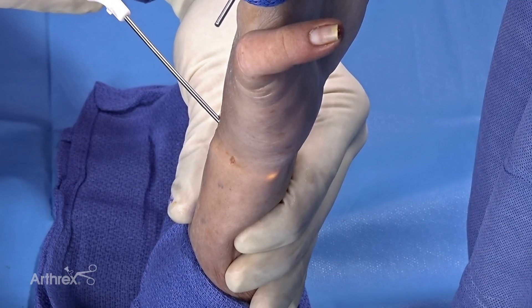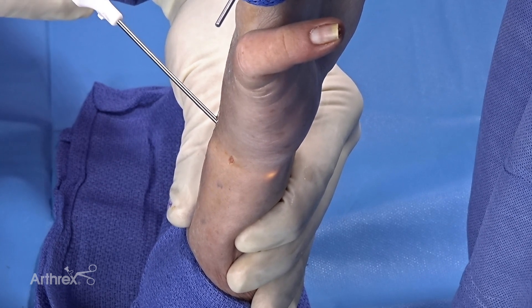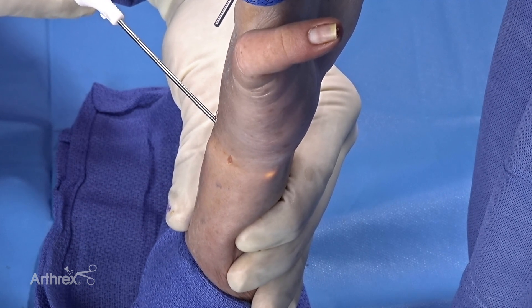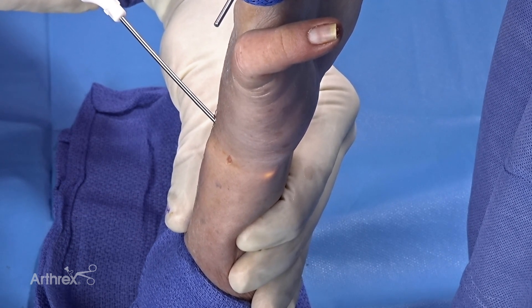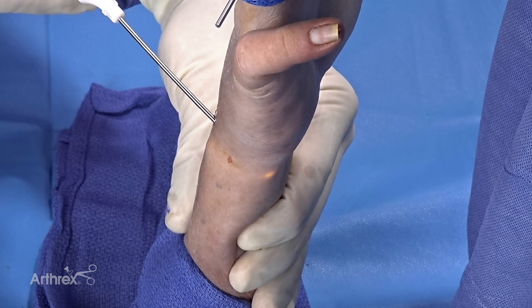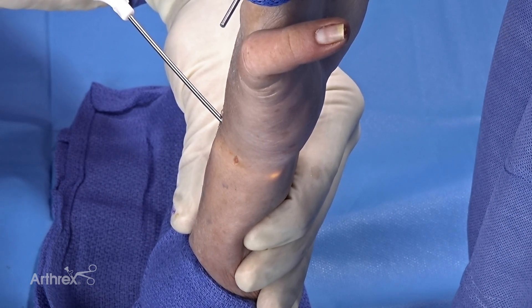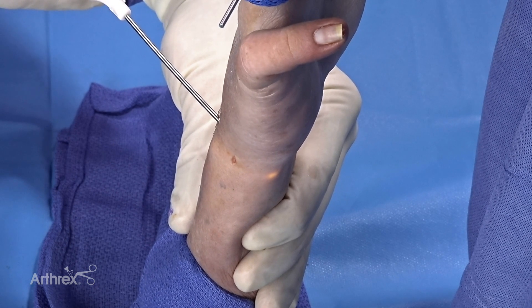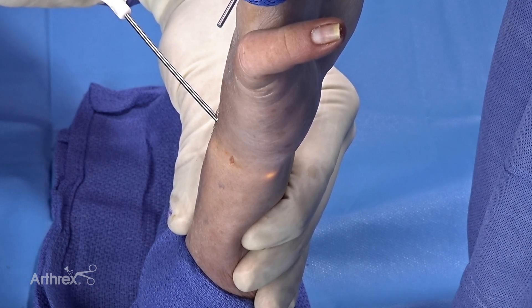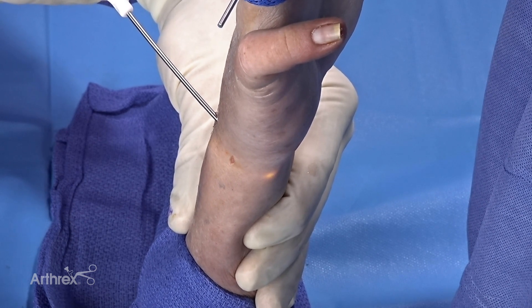Now we're going to make the accessory portal for the DRUJ. You can do this dorsally with an accessory dorsal portal, or we can make the direct foveal portal. Using the nanoscope — remember it is flexible — you can come over the ulnar head underneath the TFCC, and you can see the transillumination in the skin there. This allows us to pass a needle and then pass other arthroscopic equipment through this portal. Remember to be careful of ulnar neurovascular structures in this area, such as the dorsal sensory branch of the ulnar nerve or the ulnar neurovascular bundle, but pointing to the ulnar aspect we should be safe in this region.